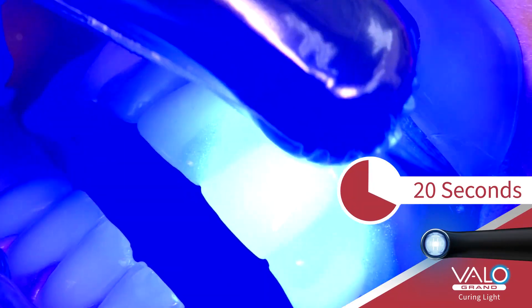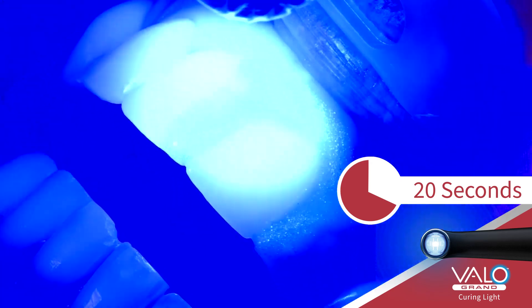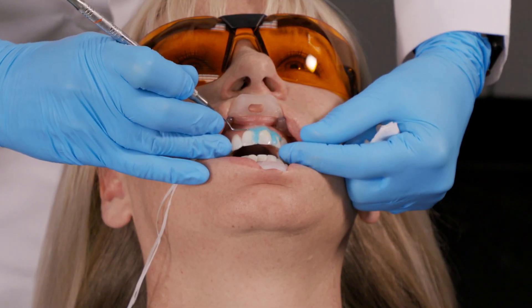Light cure the resin for 20 seconds using a scanning motion. Carefully check the resin cure with an instrument.